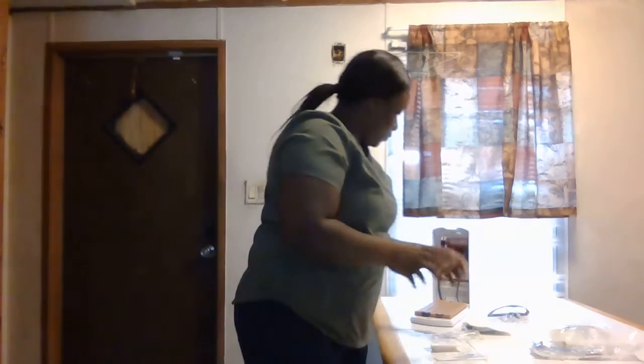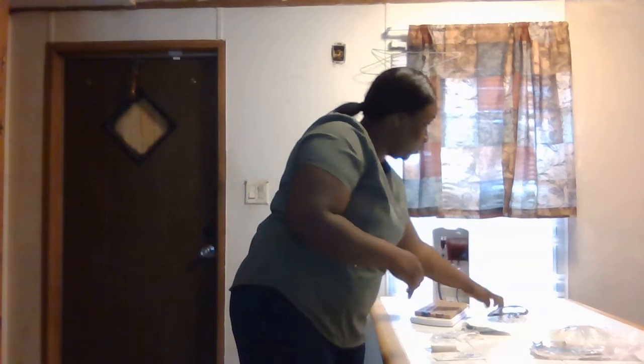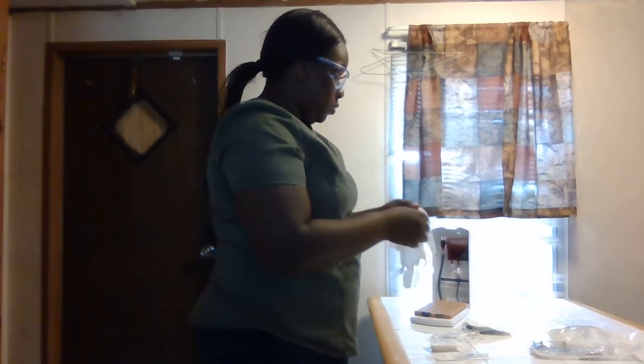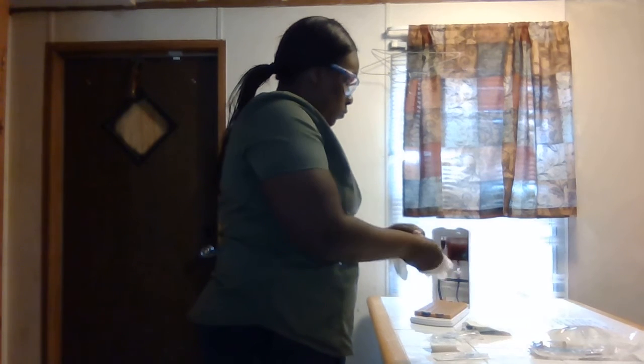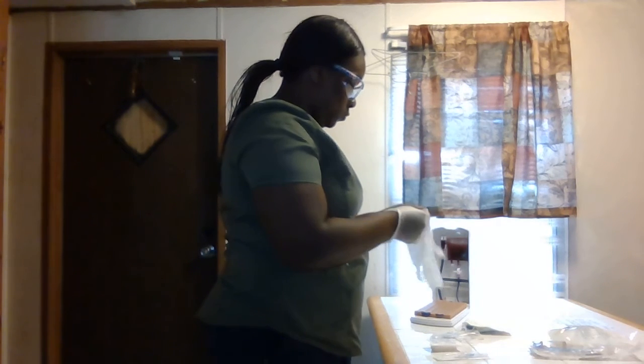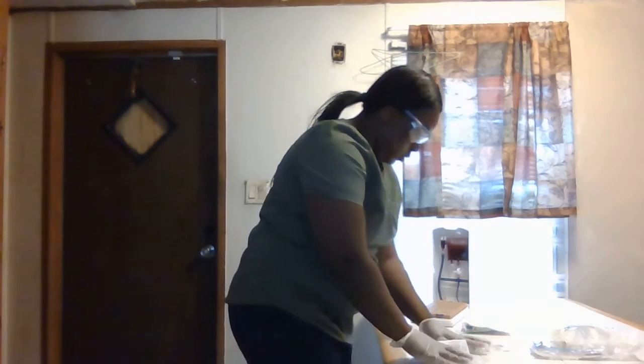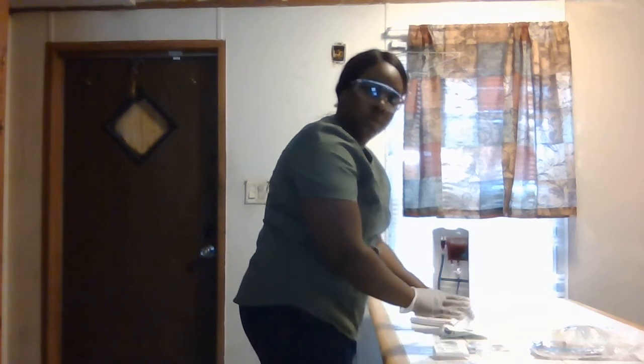Okay, so I'm going to perform my venipuncture. Again, my hands are washed. Put on my goggles and my gloves. Okay, can you see?